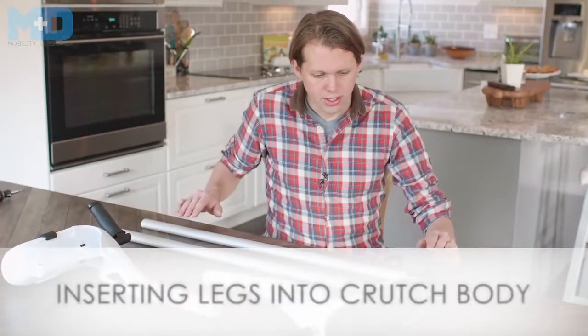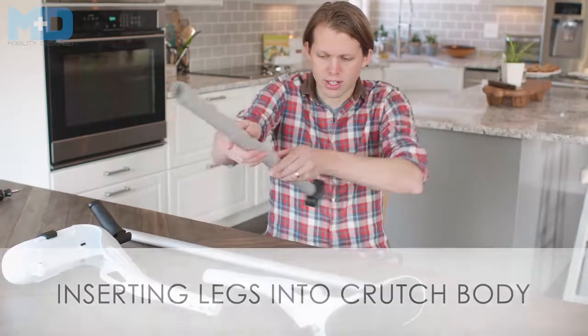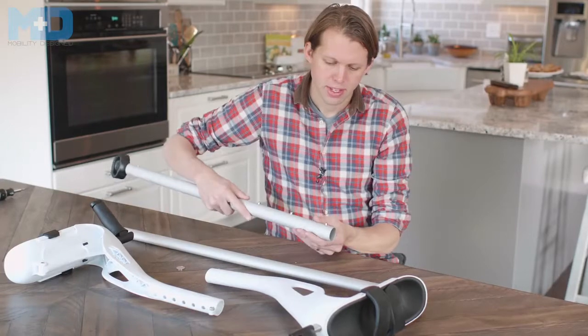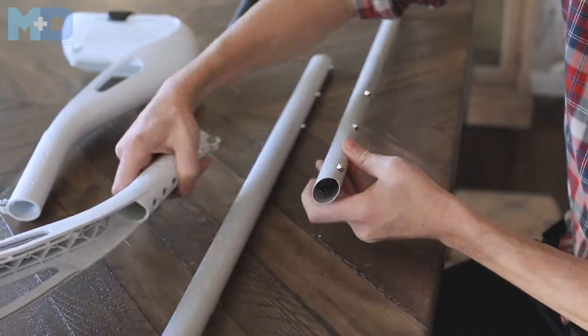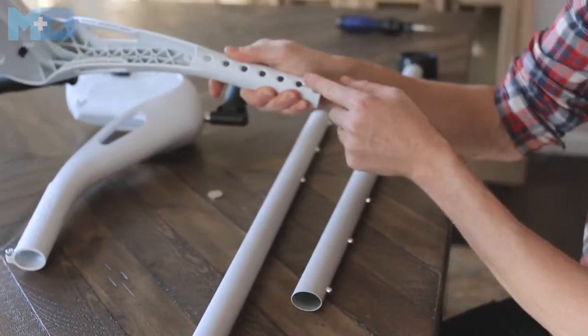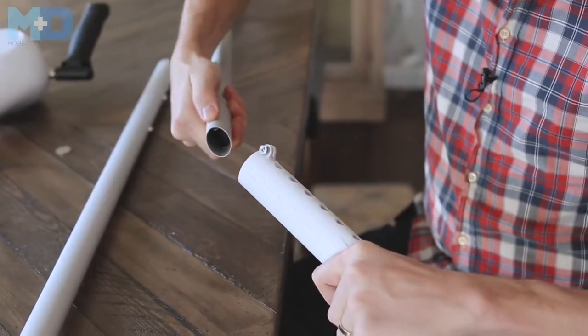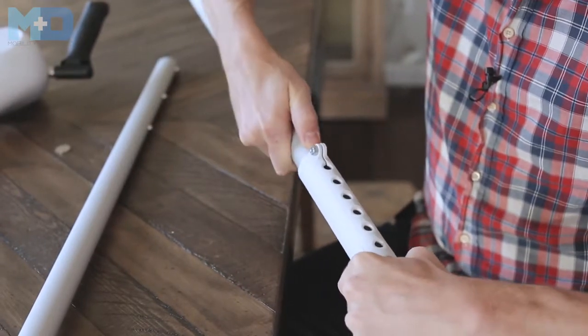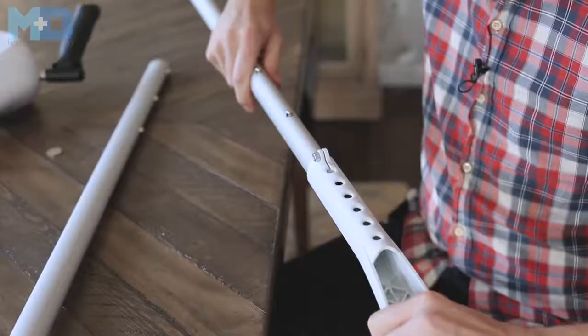So after you've inserted both feet into the crutch legs, we want to take and align the crutch leg to insert into the body. On the back of the crutch leg, there are 3 snap buttons that align with the 3 holes on the back of the crutch body. To insert the leg, you depress the snap button, like so, and slide in the bottom of the crutch leg until you hear an audible click.